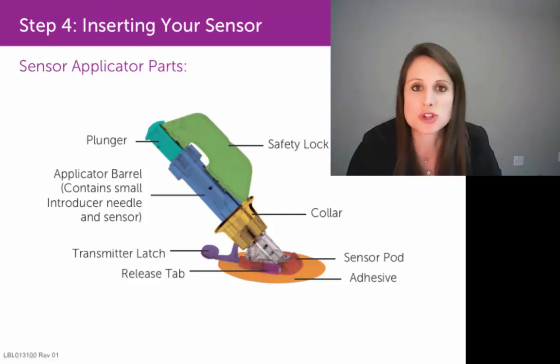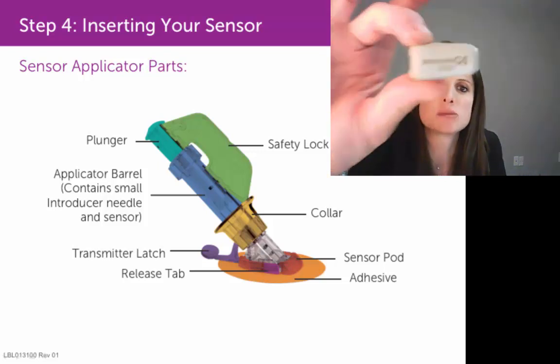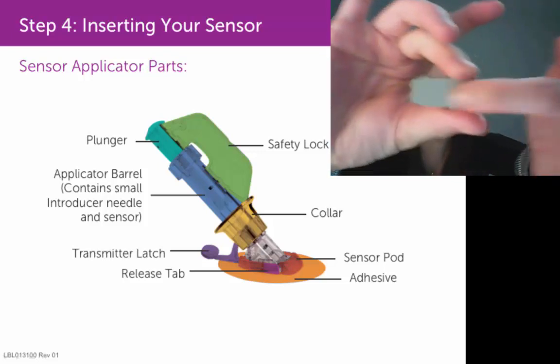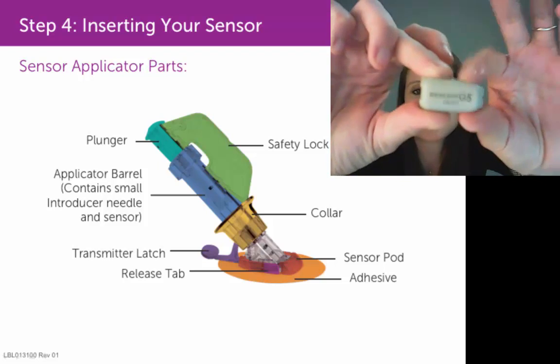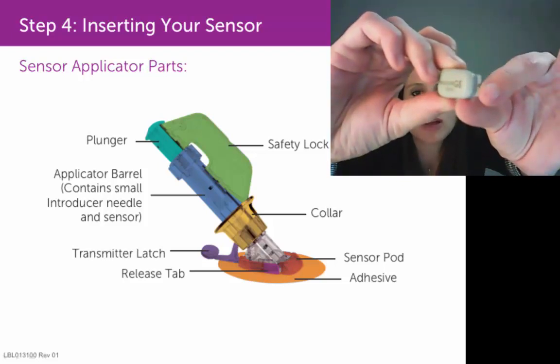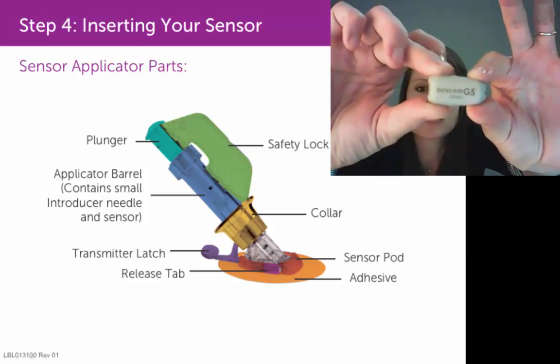At that point, you'll want to insert the transmitter into your sensor pod. Take your transmitter and clean the back of it with an alcohol pad. You'll notice there's a narrow end that says G5 — or yours might say G4 — with two little gray teeth that stick out. You want to insert that side of the transmitter into the sensor pod first.